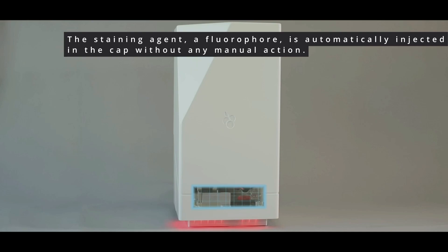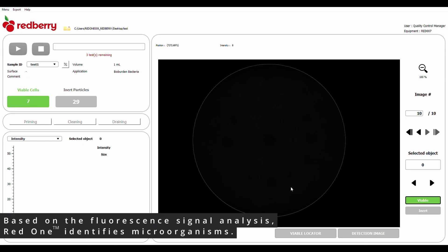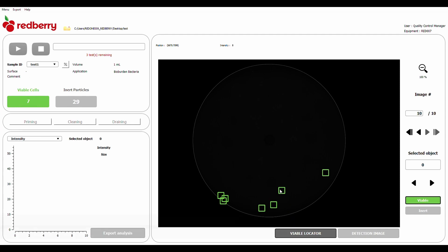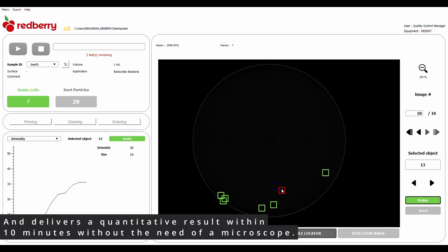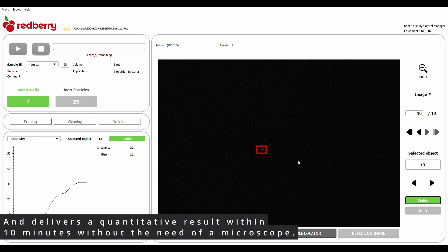The staining agent, a fluorophore, is automatically injected in the cap without any manual action. Based on the fluorescent signal analysis, RedOne identifies microorganisms and delivers a quantitative result within 10 minutes without the need of a microscope.